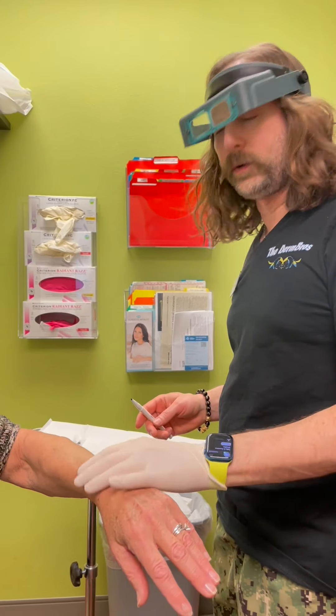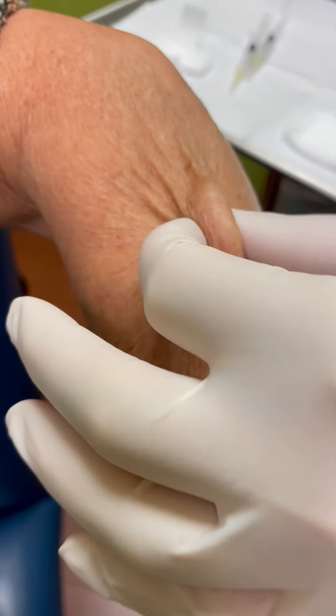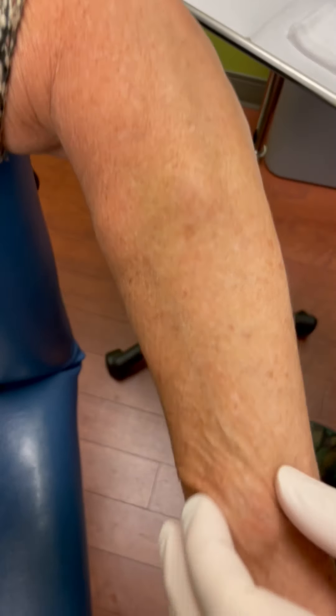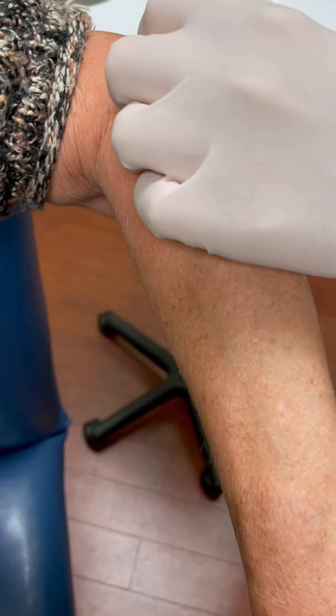So there are multiple presumed lipomas here. You can see them - they're soft little nodules, freely mobile. They could be cysts, so we're not sure because I've never removed them.